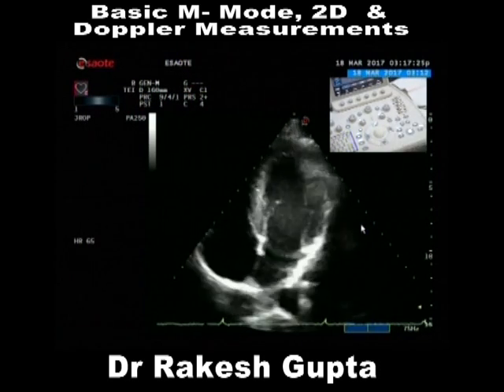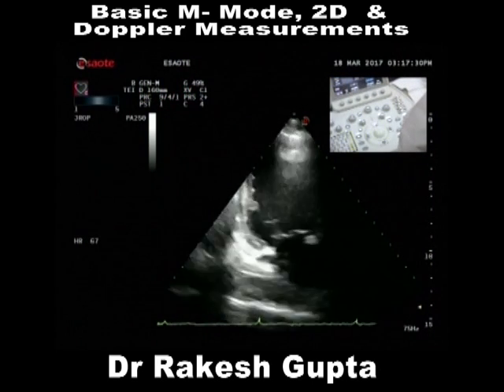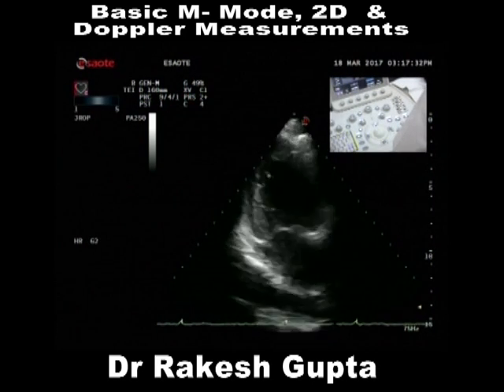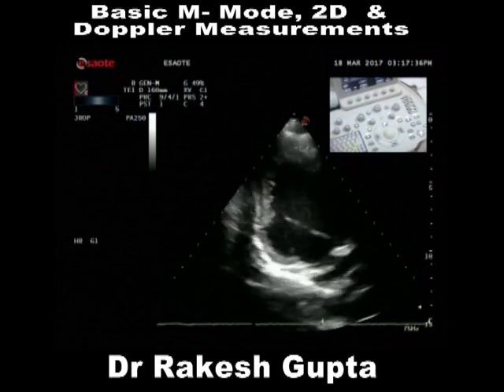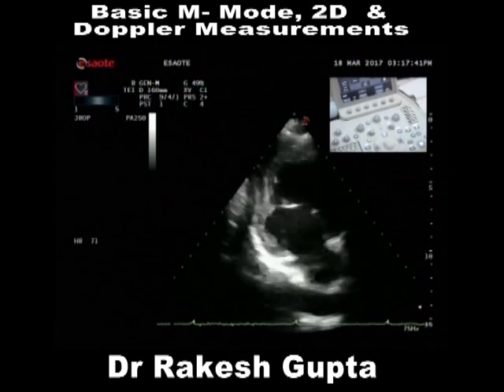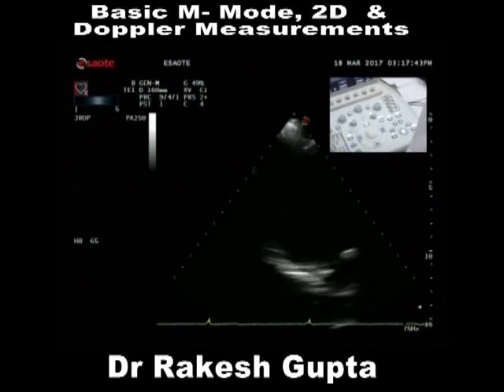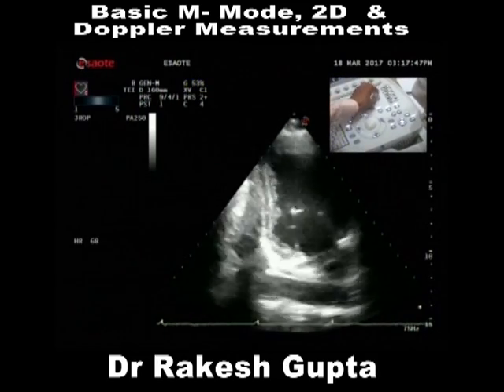Now I am going to do this same thing in the 2-chamber view. Very difficult. Many times it becomes really difficult to make a good 2-chamber view.